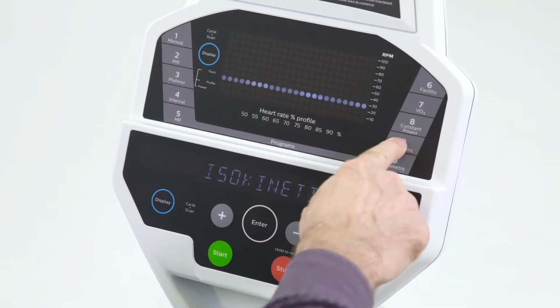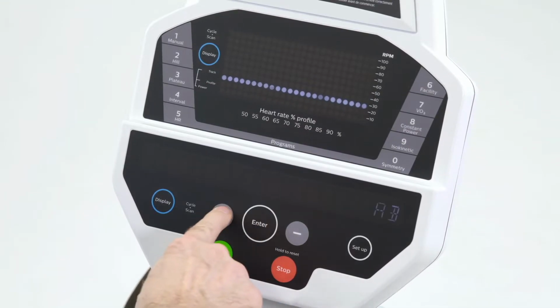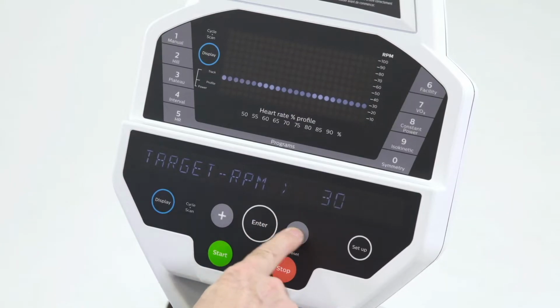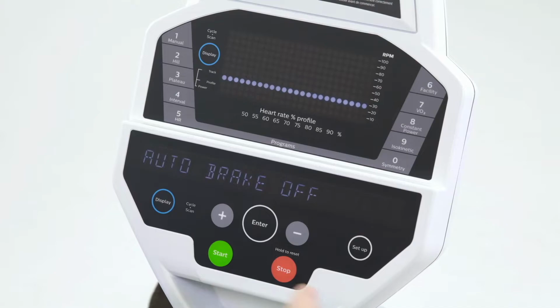The other program we have is isokinetic, which is a speed-based program. So when we come in here, we can enter a target RPM. Let's go to 30, press that. Here on this program, we suggest to leave the auto brake off because if it's on, it could affect the program with an asymmetrical patient. So I'll leave that off.